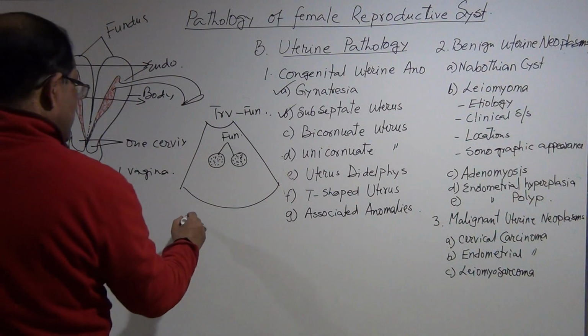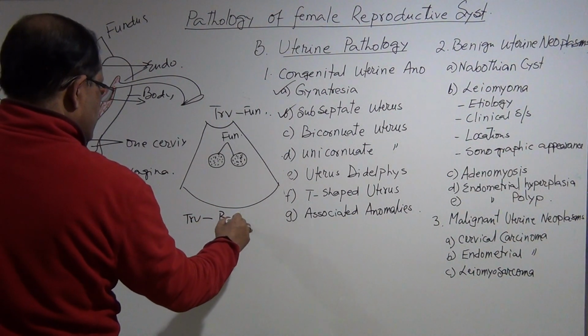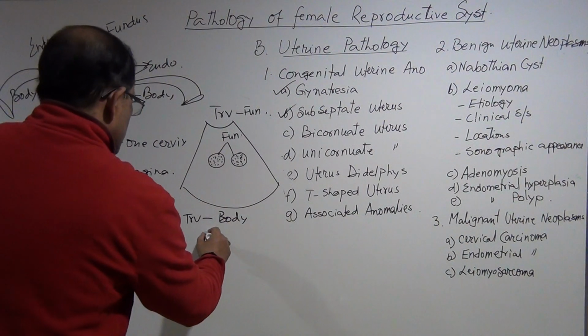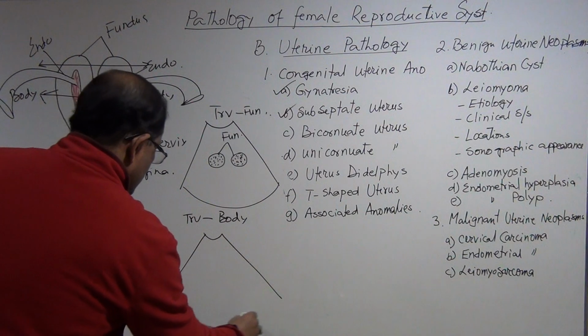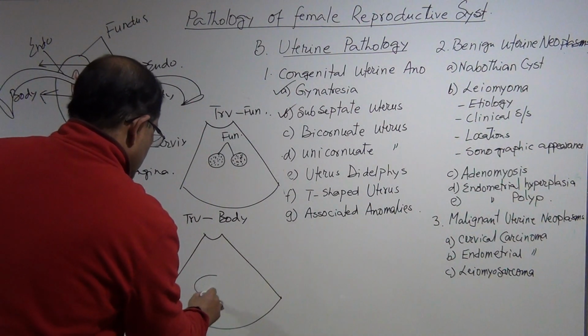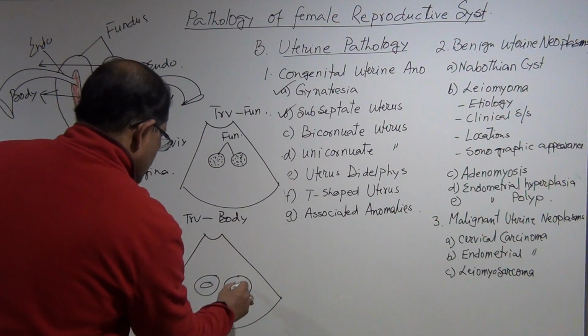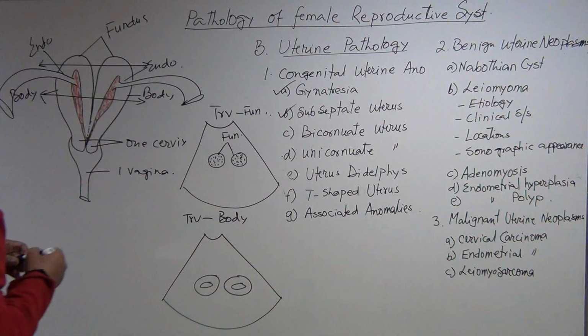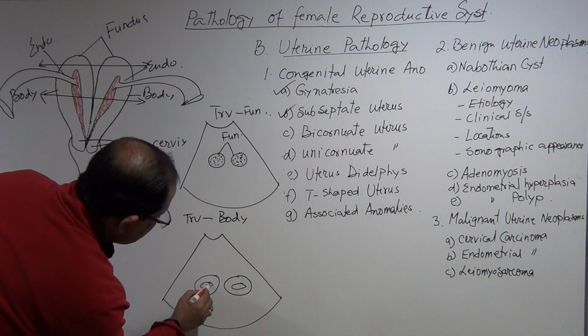And now, transverse through body. Okay, you will see two bodies and two endometrium.